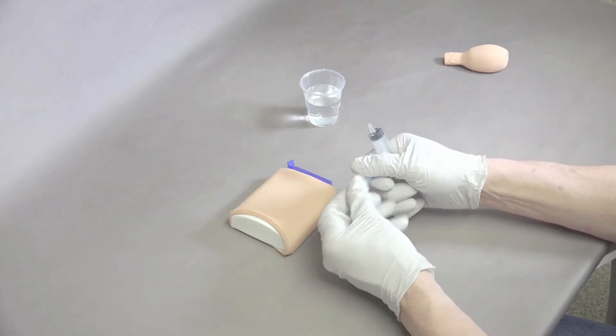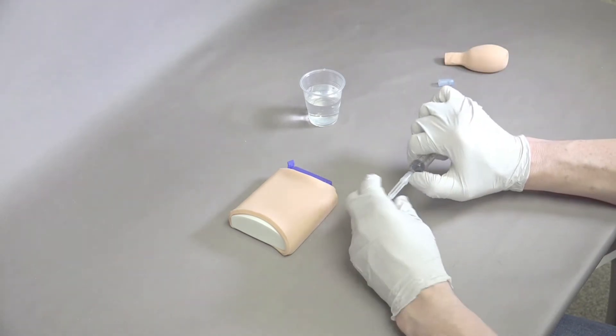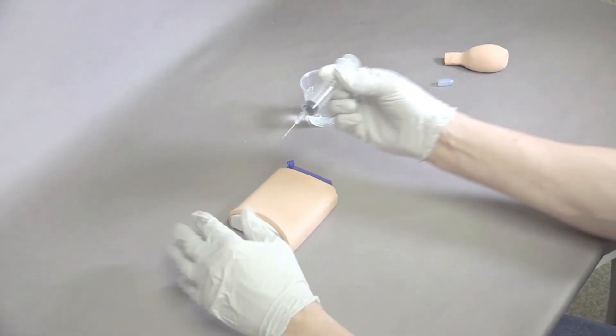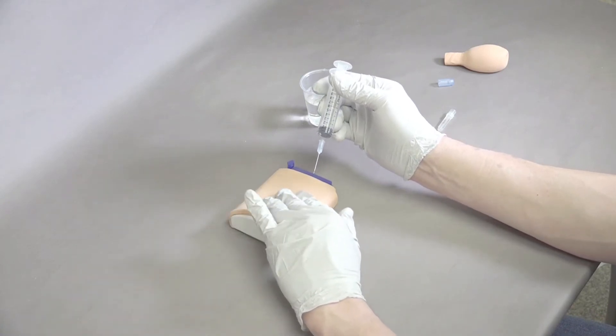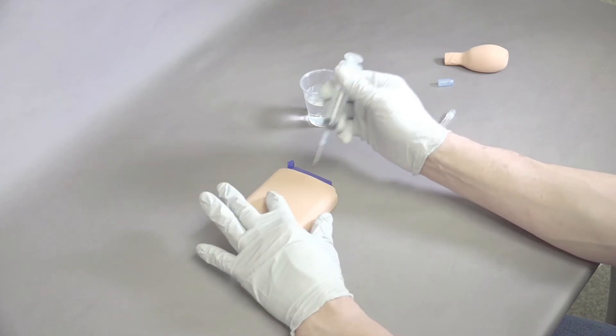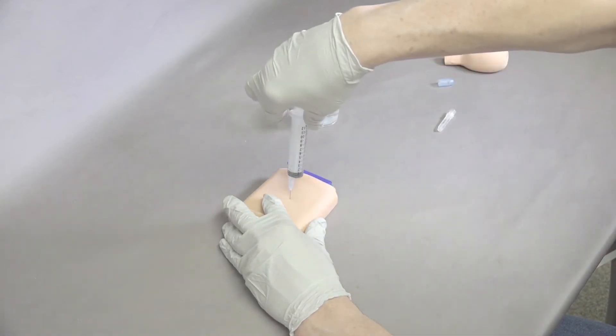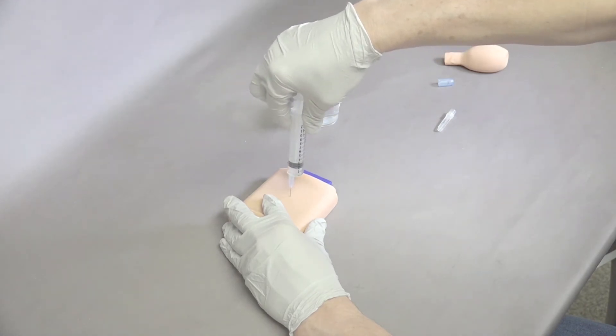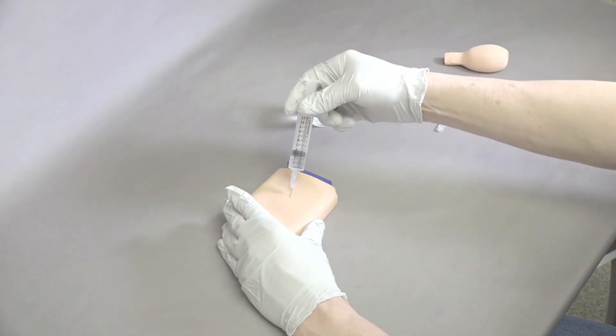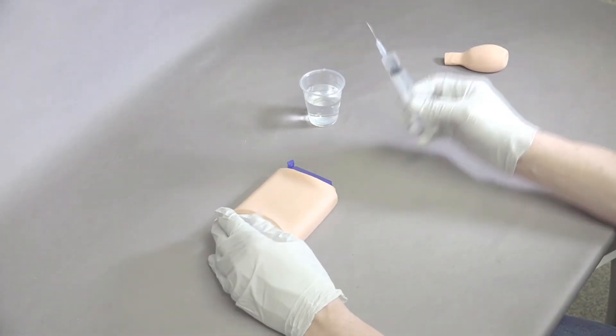Now take the syringe and needle. In this case we're using a 22 gauge needle, just an inch long. We can palpate the bladder and feel where it is. You can see the bladder moving under the skin. Go straight in and draw up the simulated urine. If you want to add yellow food coloring to make it more realistic, you can. Bring this out and we've got a sample.